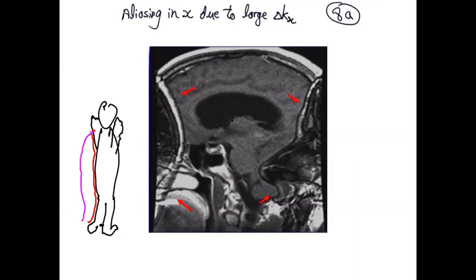When they prescribe the exam, they prescribe it with a field of view covering this area. So the sampling was such that you'd be able to reconstruct this particular, let's do it in green, this field of view. But the tube has fluid in it, and it was outside of the supported field of view, so it wasn't sampled enough.